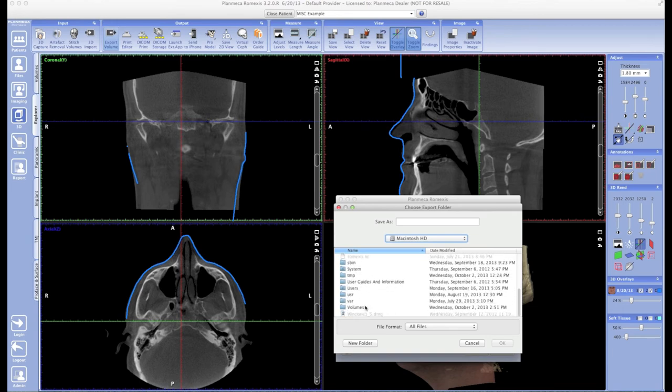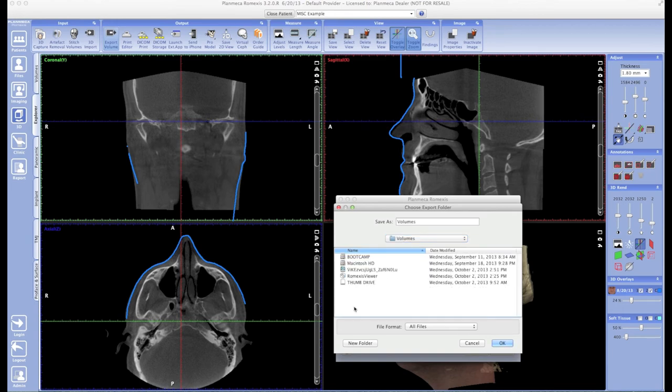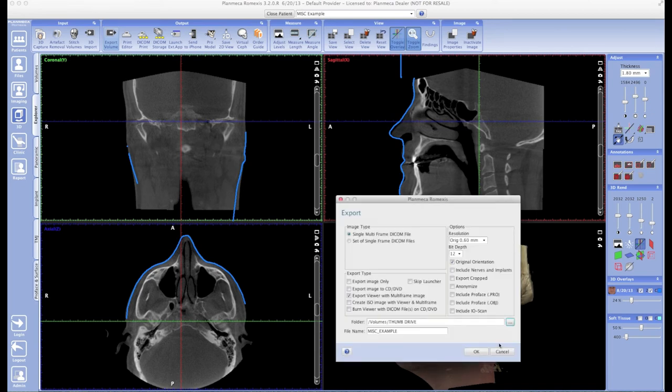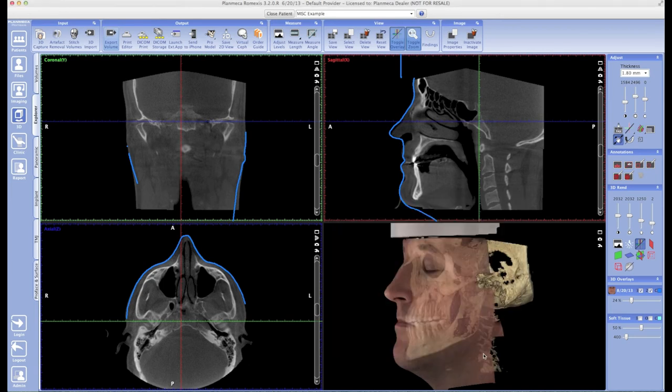At this point, I'm ready. I can go ahead and hit OK, and it'll start exporting the viewer and that multi-frame image right to my thumb drive. Once finished, the thumb drive will actually act a lot like the disc we just burned.